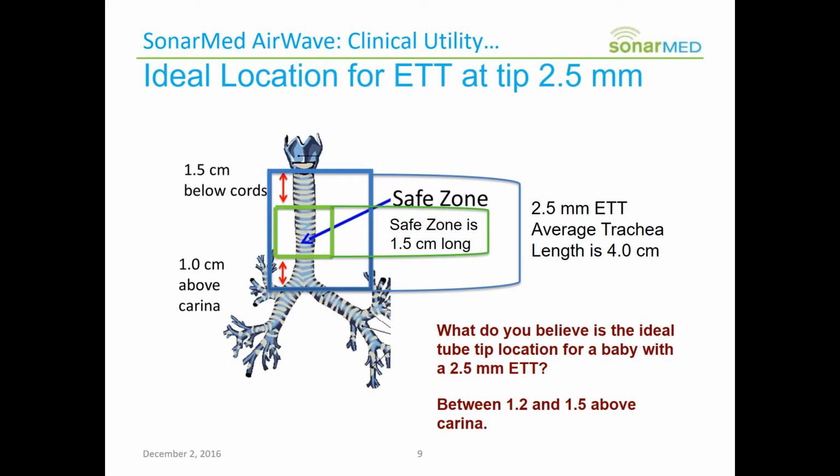That's one of the whole points of this, is that I can watch the tip of the tube continuously and carefully monitor where it is so that I know my baby's endotracheal tube is safely placed in the trachea.